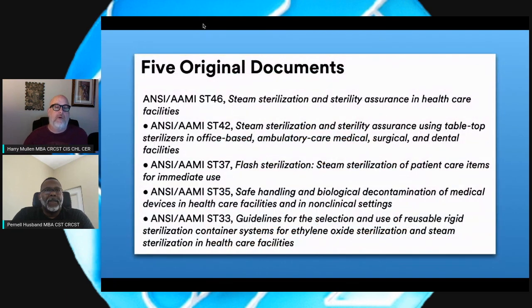So what they do is really dictate to the vendors or manufacturers how the information should be presented to the individual so that we know how to properly operate their equipment, how to process their equipment and such. Absolutely.